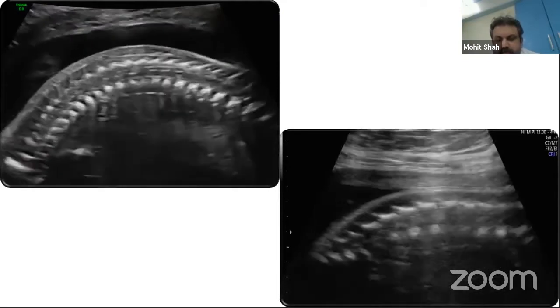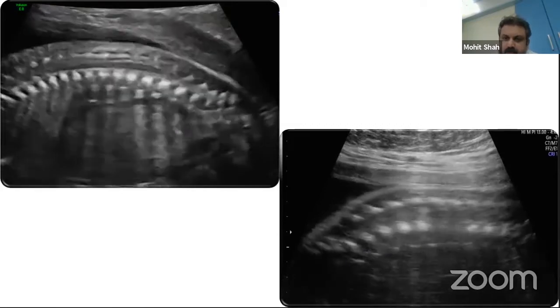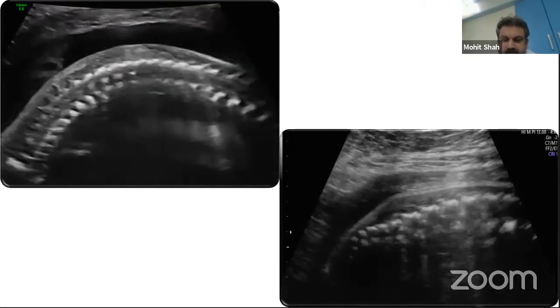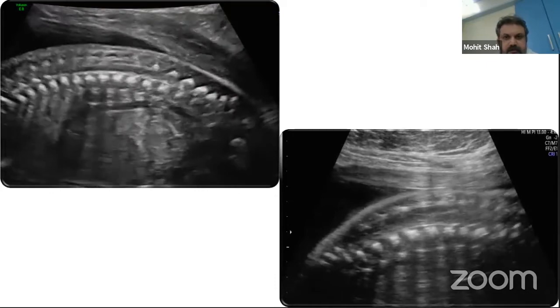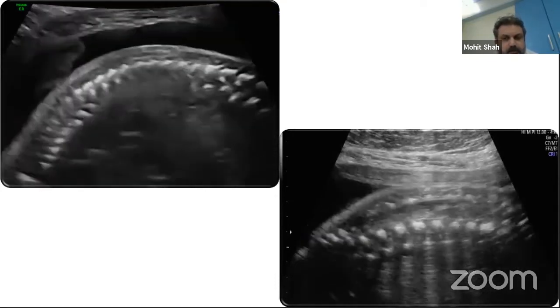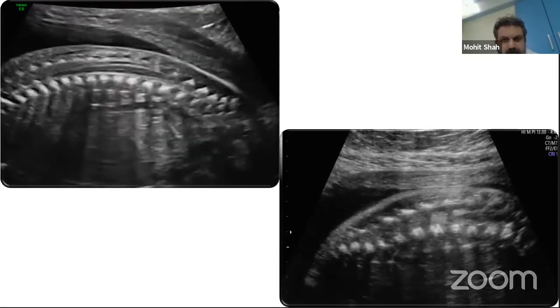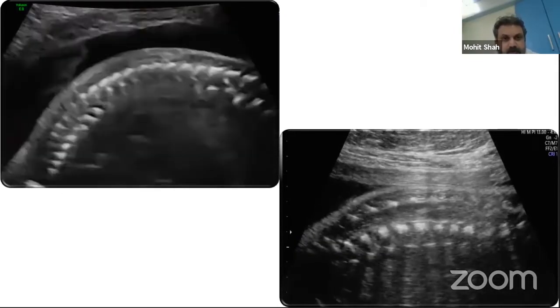And in fact, when you document an image, it is wise that you go from the conus medullaris up to the sacral tip, so that if you want to calculate the vertebral bodies, it becomes easier when you have documented the lower portion of the conus along with the sacral tip. Also, it allows you to visualize normal variants like a filar cyst or even a ventriculus terminalis, which otherwise would have been difficult with a low frequency convex transducer.